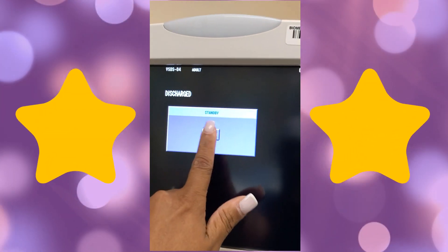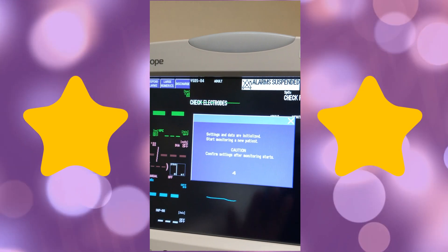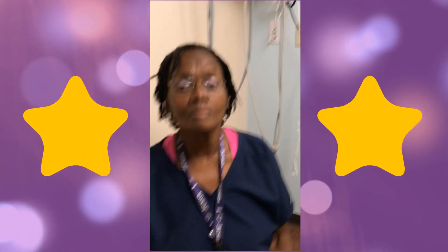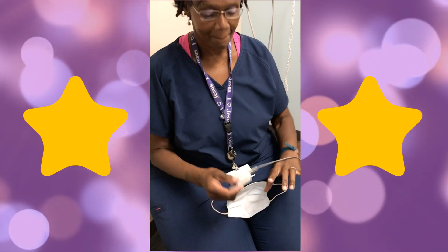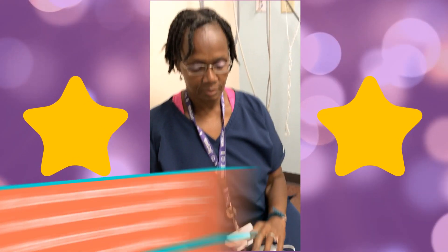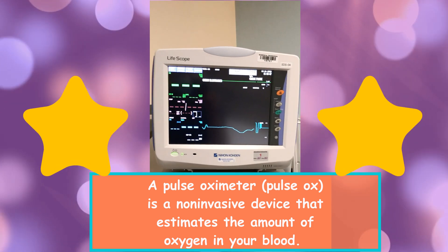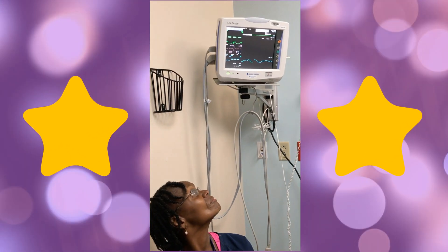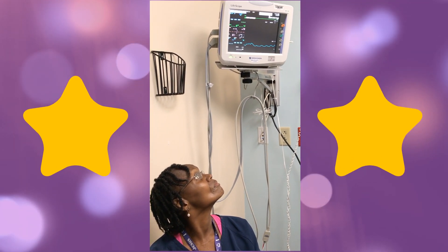I'm going to turn the machine on and the only thing we're going to be monitoring is the pulse ox. My volunteer, my little assistant Evelyn, is going to put the pulse ox on her finger. I'm going to position it so you can see the screen, and as you can see, she has no mask on.